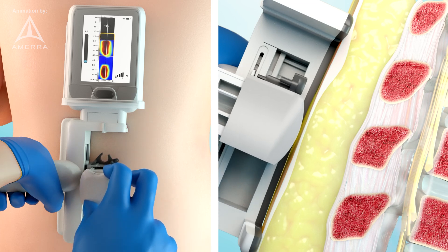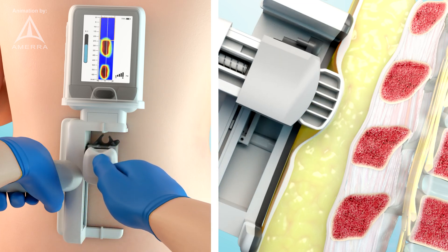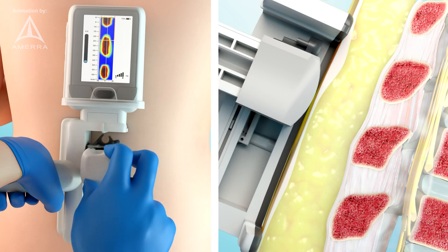Observe the output on the screen. The blue areas correspond to low pressure, indicating tissue or ligament, and the red areas correspond to high pressure, indicating the bony spinous processes. From the image, select a location between the spinous processes that would be suitable for needle insertion.